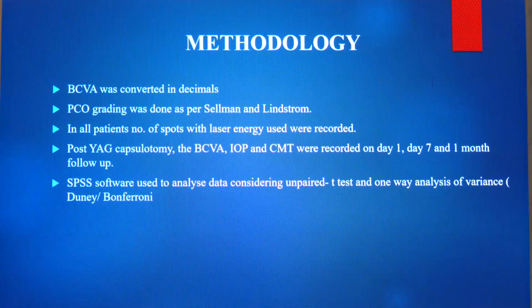Methodology: best corrected visual acuity was converted into decimals. PCO grading was done as per Selman and Lindstrom grading criteria. In all patients, the number of spots and laser energy used were recorded. Post Nd:YAG capsulotomy, the best corrected visual acuity, intraocular pressure, and central macular thickness were recorded on day 1, day 7, and 1 month follow-up. SPSS software was used to analyze the data, considering unpaired t-test and one-way analysis of variance.